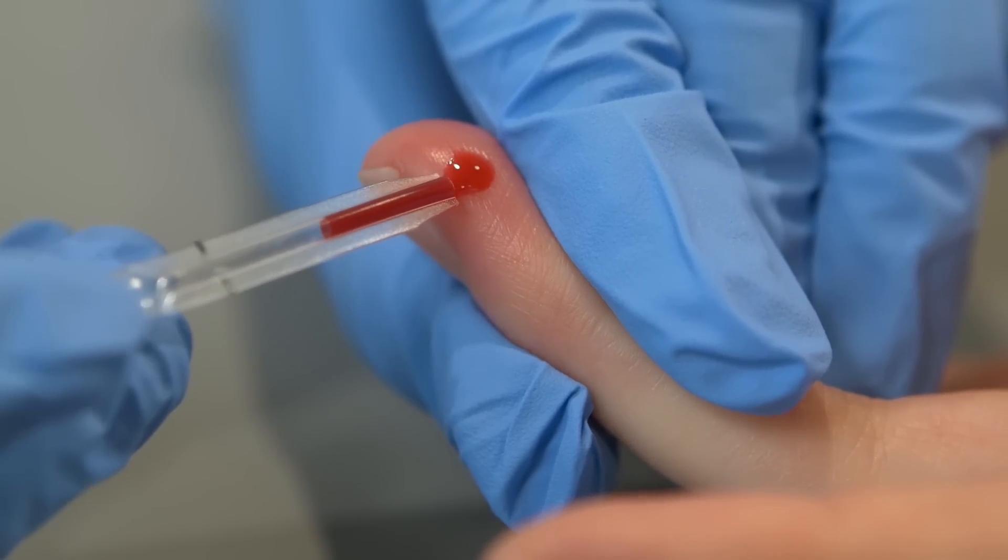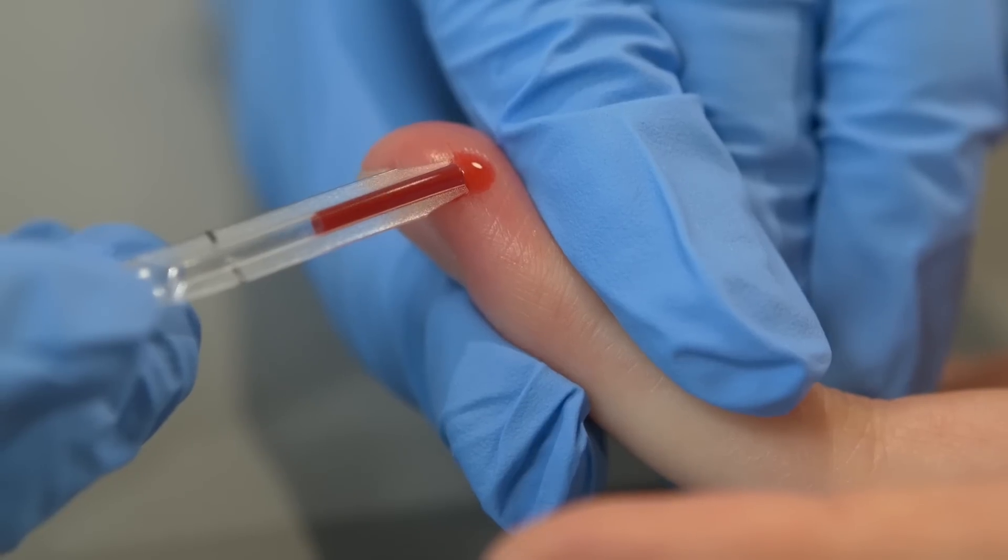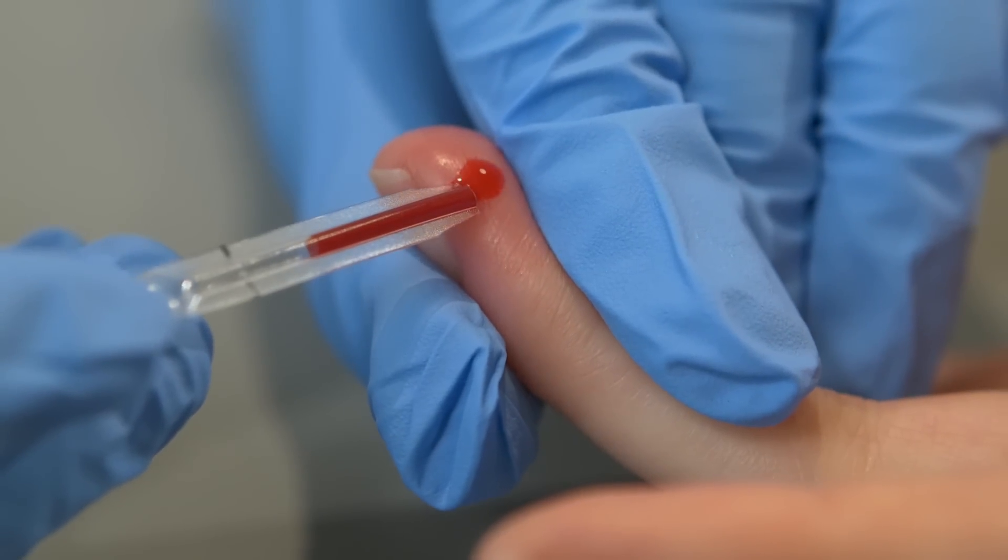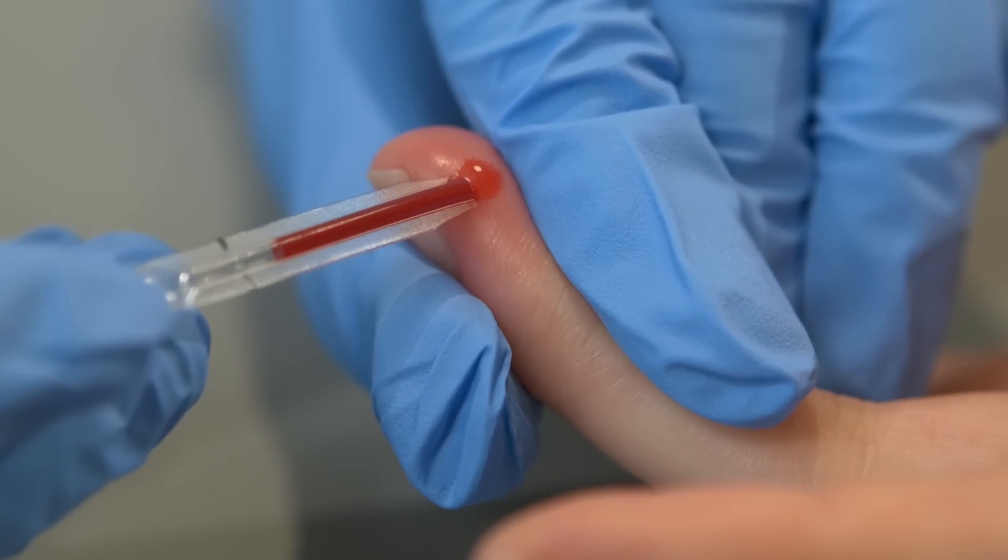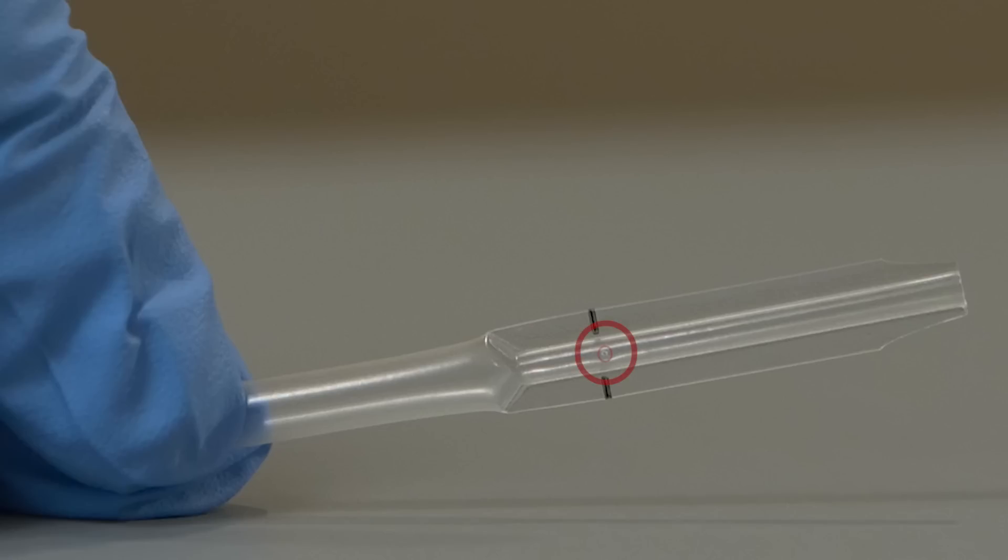Capillary action will automatically draw the blood to the black fill line. Do not squeeze the bulb of the pipette. Hold horizontally and gently, being mindful not to cover the pin-sized hole on the 50 microlitre fill line.